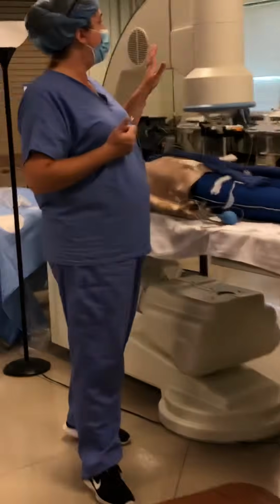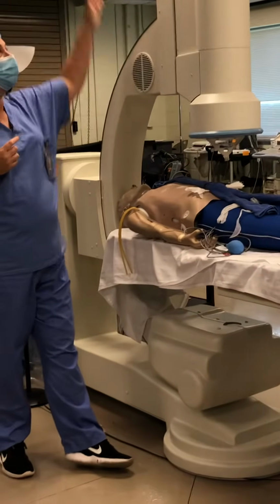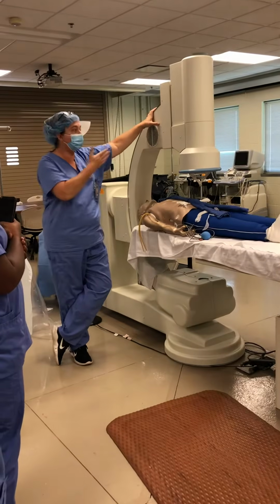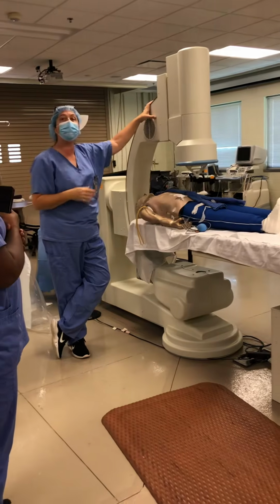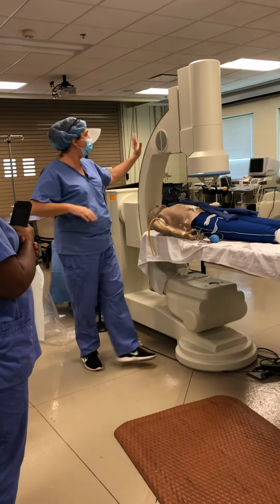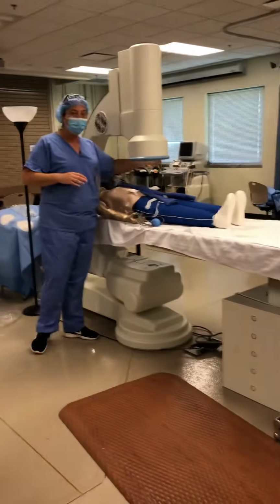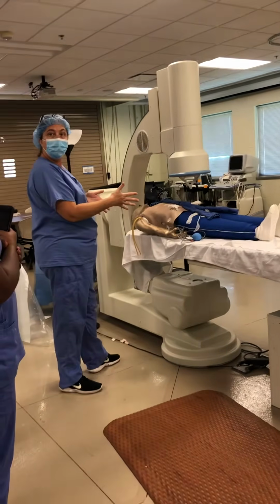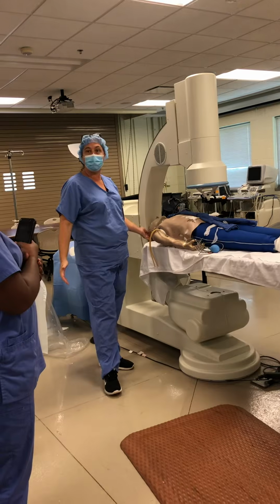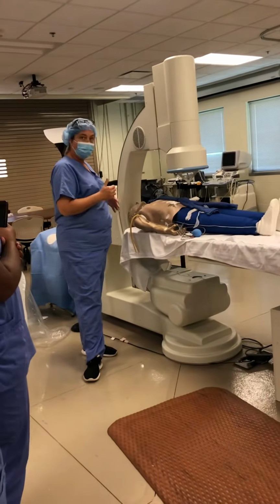So in the peripheral labs, as I've already mentioned, those C-arms come from the ceiling. And a lot of labs, even the non-peripheral ones, they hang from the ceiling. They're not floor mounted like this one is. And so you can actually swing this C-arm out to the side, that side or this side. Because you see we're stuck, that's as far as we can go down because of the table in this kind of a setup.